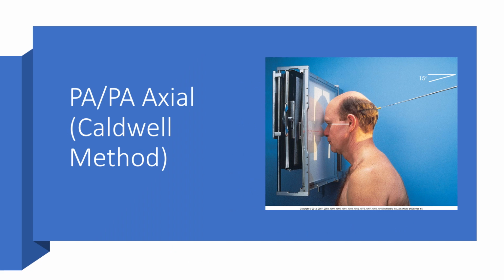All right, on to the Caldwell projection. Well, how do we do a Caldwell? Well, the patient's nasion is centered to the image receptor. Okay, I'll say that again.